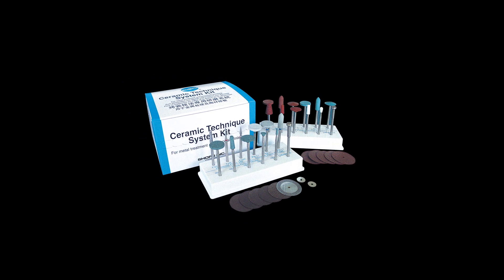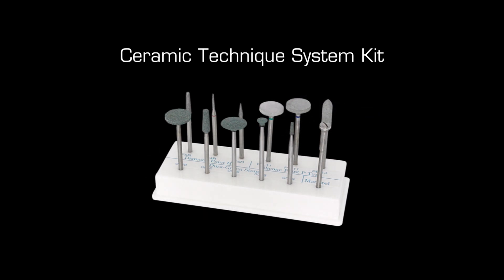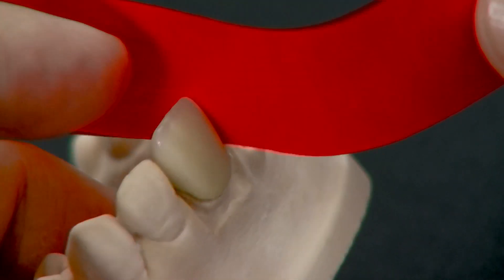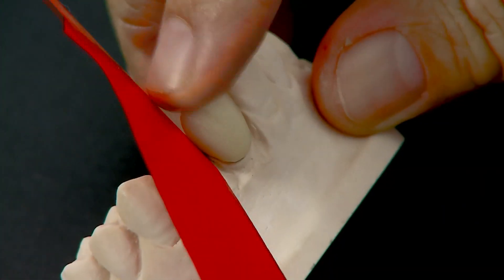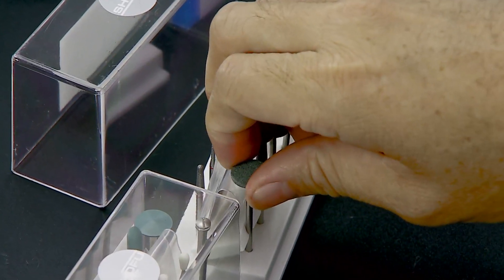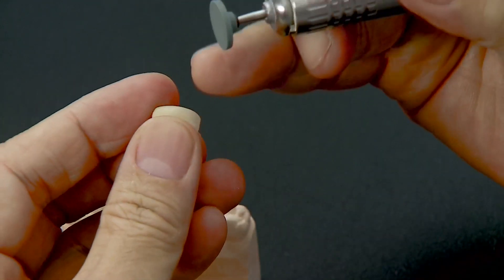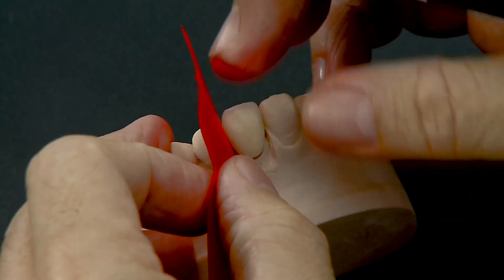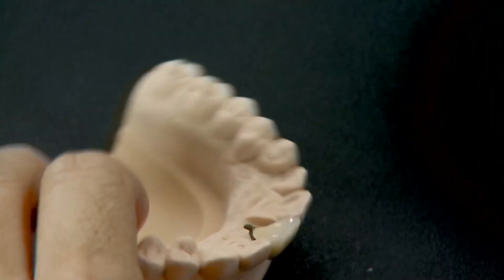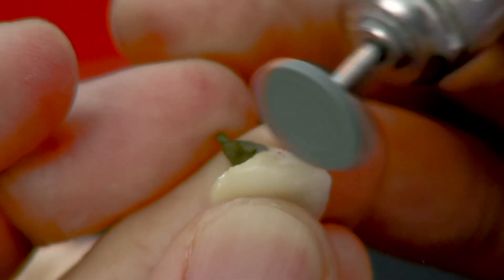Anatomical contouring is an essential step where all fine surface details are recreated. The Ceramic Technique System Kit is designed with a detailed selection of abrasives for finishing and polishing both the metal and porcelain surfaces of a porcelain-fused-to-metal restoration — a handy tool for both beginners and experienced ceramists. Place the crown back on the model, check proximal contacts with articulating paper, and adjust inter-proximal contacts with Dura Greenstone WH6. Recheck contacts and trim off remaining tight spots.